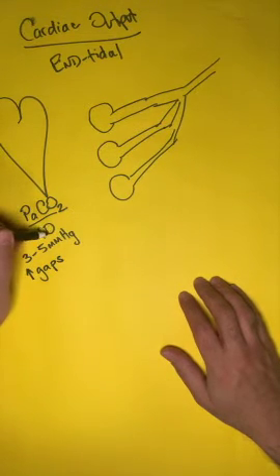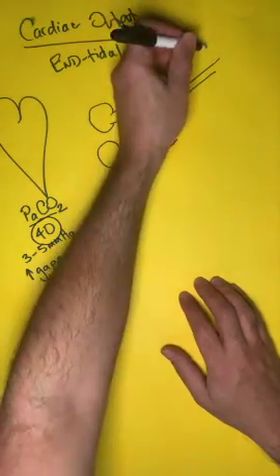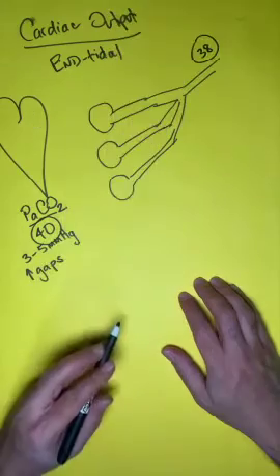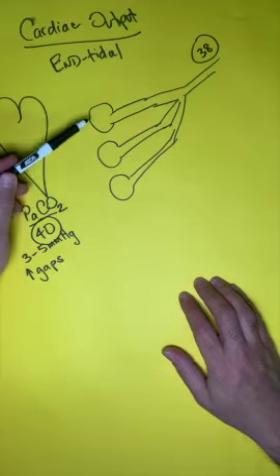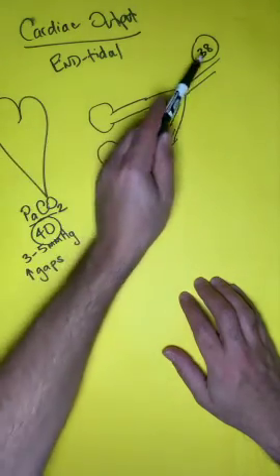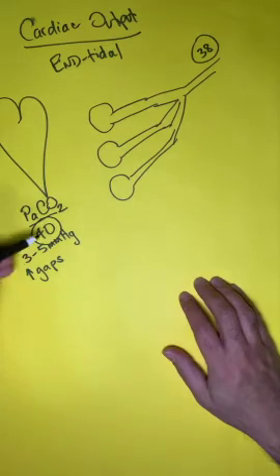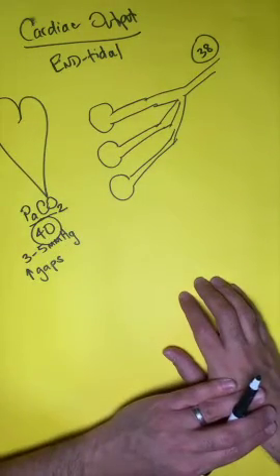Anyway, back to the example. If we have a PaCO2 of 40 with a normal cardiac output, we would expect the CO2 that's ventilated here to be, let's say, 38. If this person develops a blood clot, these alveolar units, yes, those are alveolar units, will not be perfused as well. And what we would expect is we would see a drop in the ventilated end-tidal CO2 because the CO2 that's in the blood can't ventilate out when we have our acute PE.